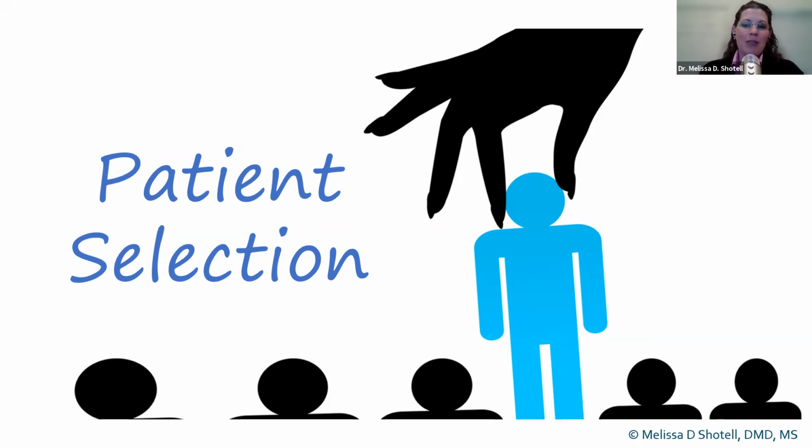That's maybe not the first case to try for in-office clear aligners. So I always say choose a slam dunk. Choose something simple. Choose a great patient that you know is going to be compliant so that you're able to really evaluate the in-office clear aligner process, not necessarily evaluating the process of complex treatment or a difficult patient initially.